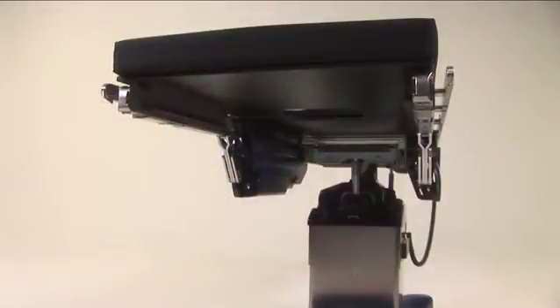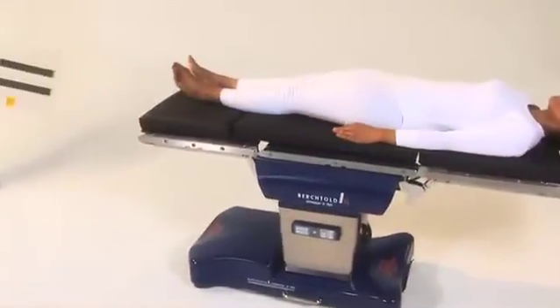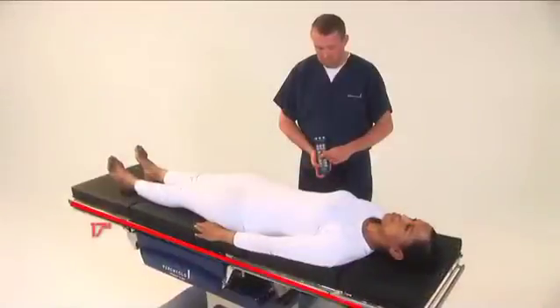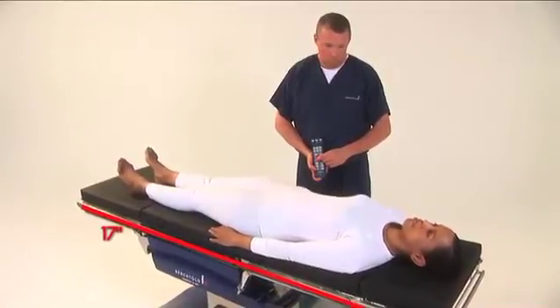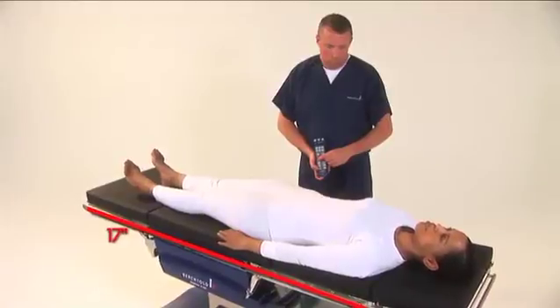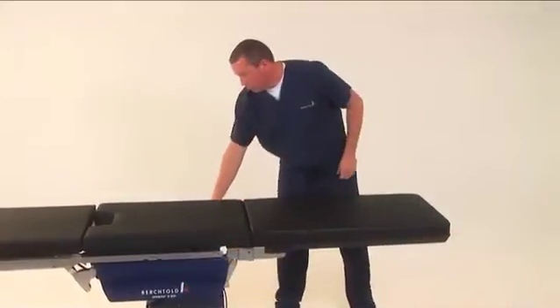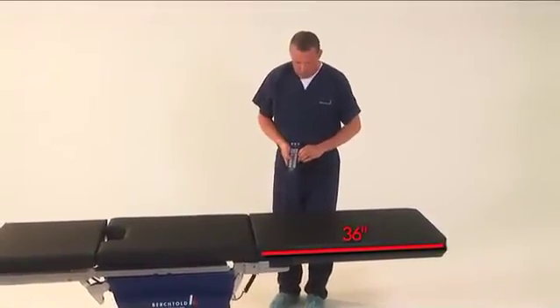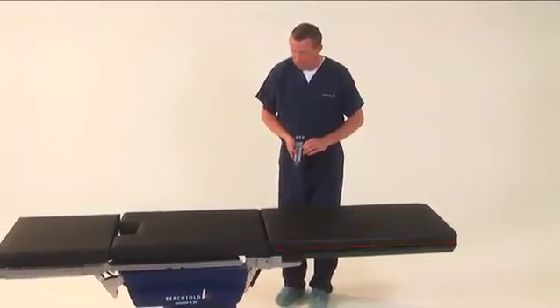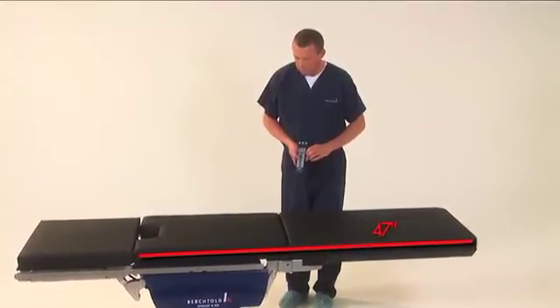The integrated x-ray cassette tunnel is 18.3 inches wide, which eliminates the need for separate x-ray tops, and nearly 17 inches of motorized longitudinal slide minimizes the requirement to reverse the patient for imaging access. With maximum longitudinal displacement toward the head and a 36-inch carbon fiber extension unit attached, the imaging area is equal to 47 inches for optimum access of the C-arm.